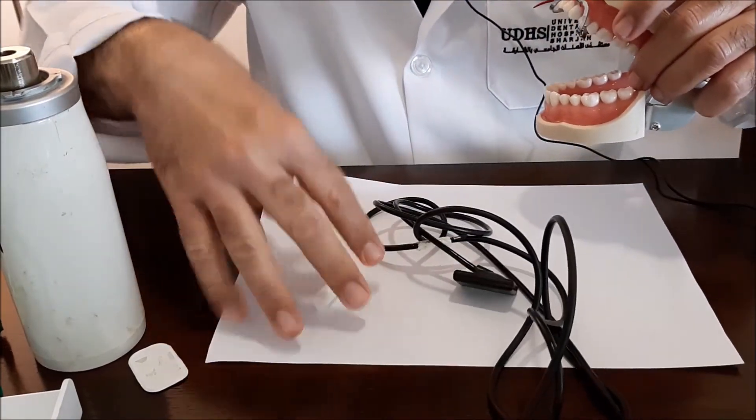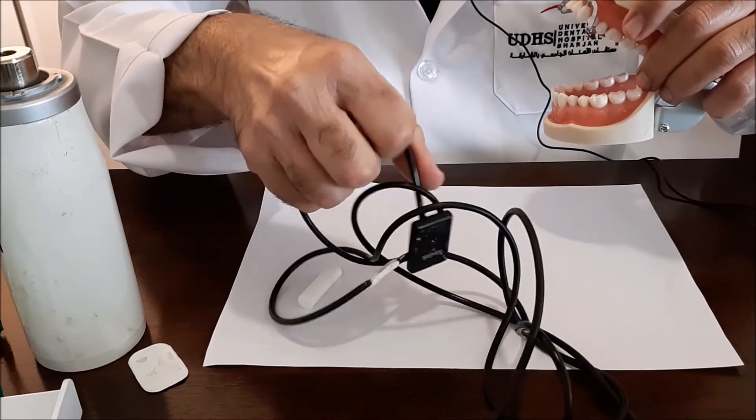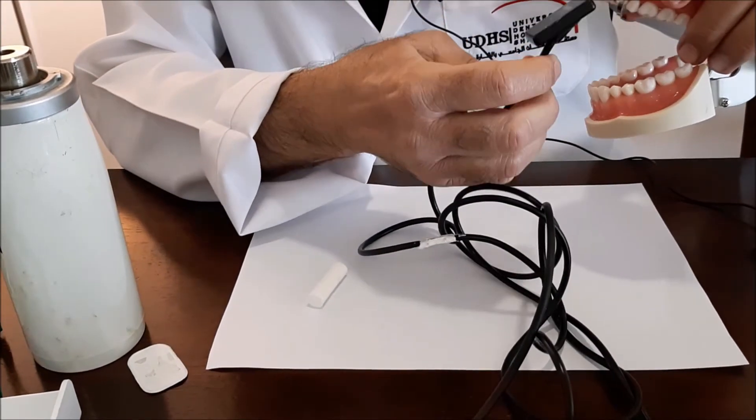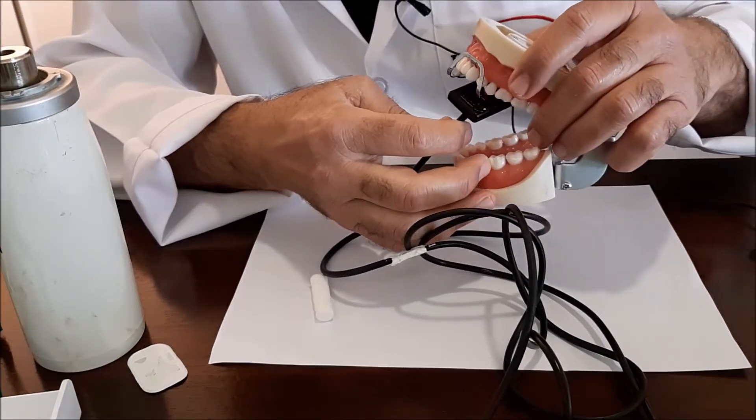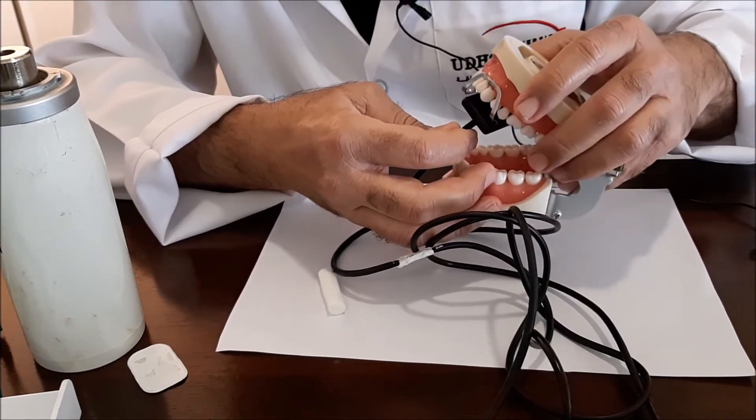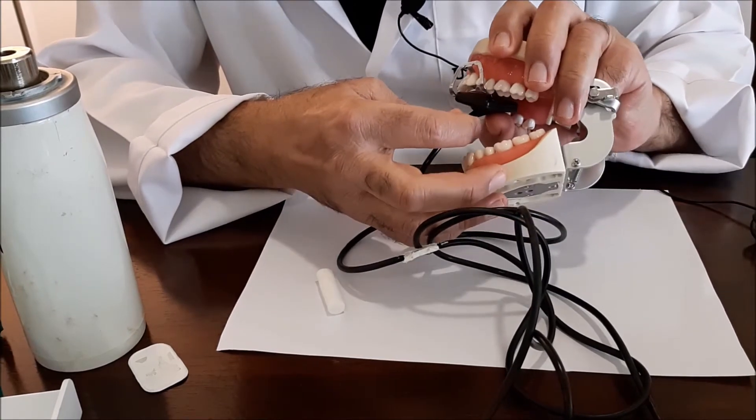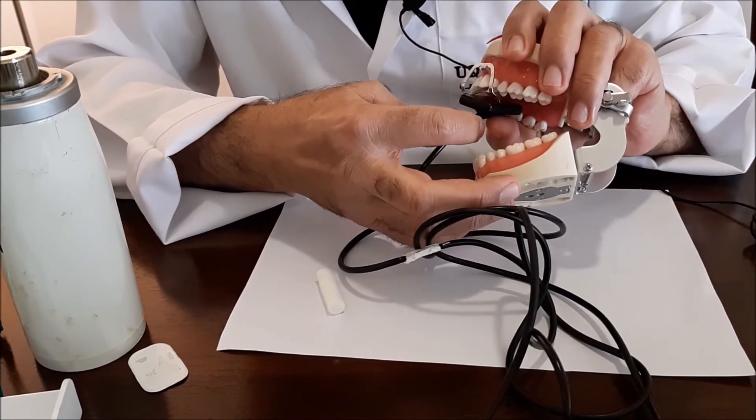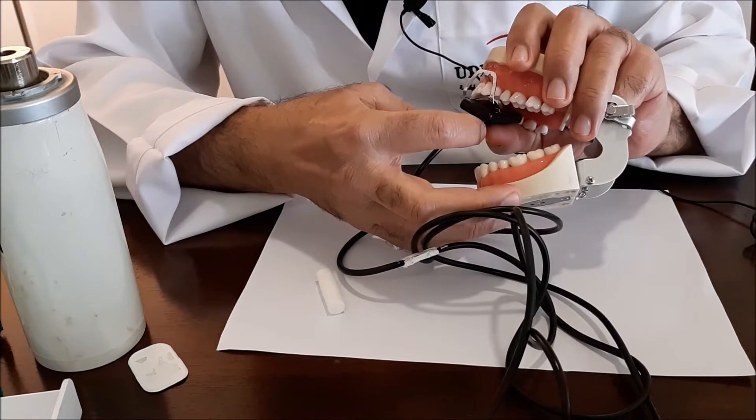Thus you're going to put the sensor exactly behind the canine. You slide the sensor all the way backwards as much as you can in order to include the canine in the radiograph.